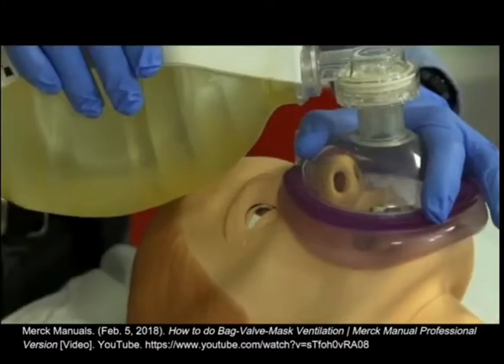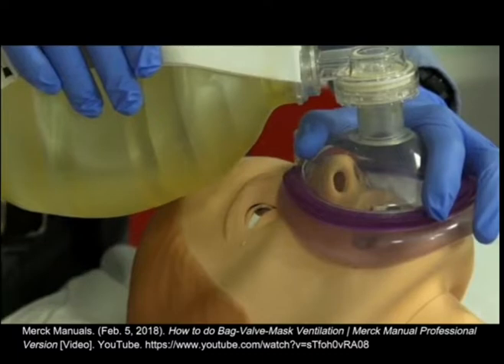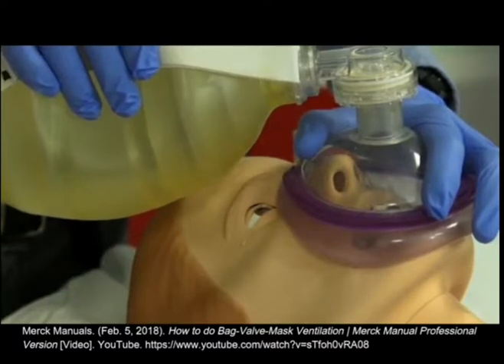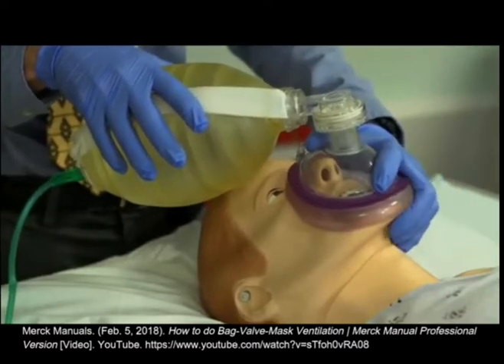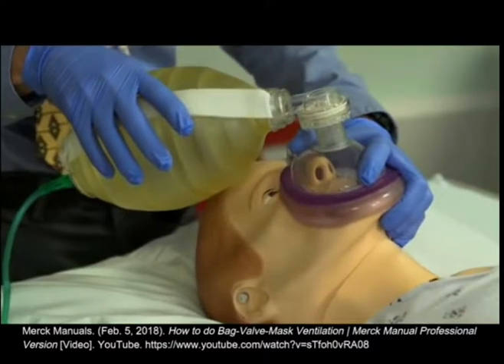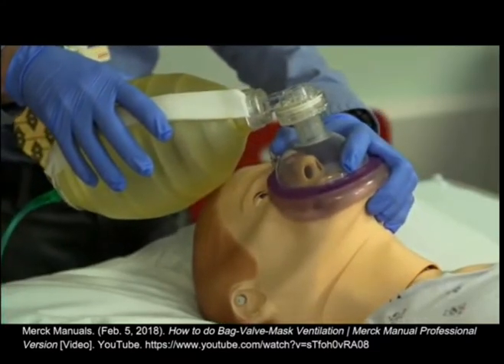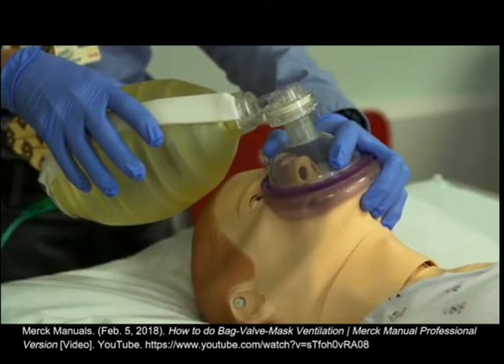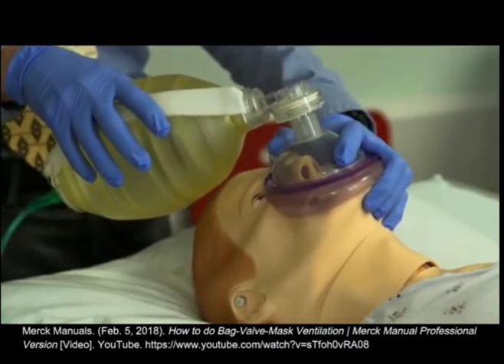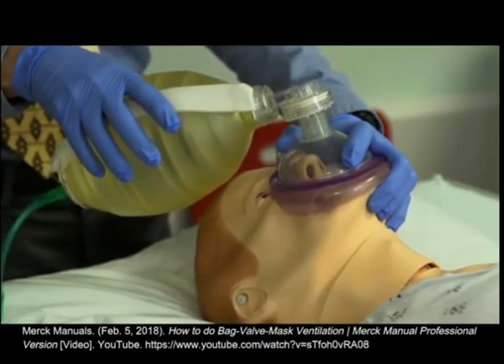Make sure you do not place your hands or the mask on the patient's eyes. Doing so may damage the eyes or cause a vagal reaction. Place your middle, ring, and little fingers under the patient's mandible and pull it upwards into the mask. This maneuver is similar to that of the head tilt chin lift technique, and it further opens the airway. While these fingers maintain upward traction on the mandible, the thumb and index finger hold the mask tightly to the face and ensure a proper mask seal.